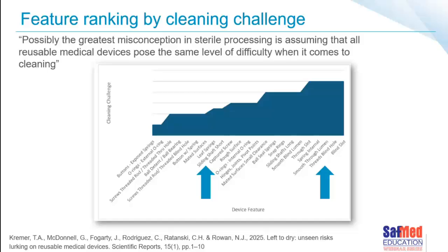It says over there that possibly the greatest misconception in sterile processing is assuming that all reusable medical devices pose the same level of difficulty when it comes to cleaning, because they don't. Different parts or structures are very, very important. And I learned new words like mated surfaces. I didn't know those words existed. About lumens and springs and hinges and more in-depth geometry of actual instruments.